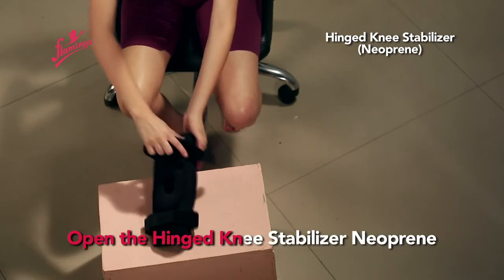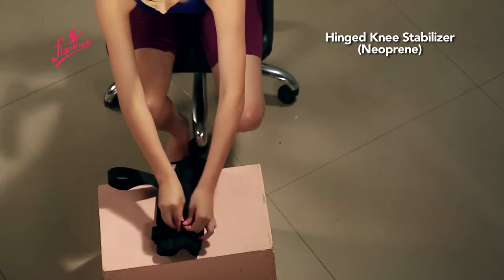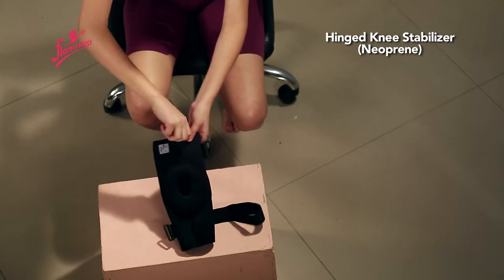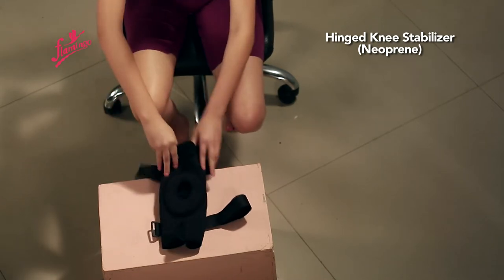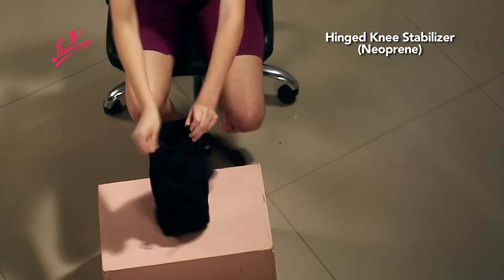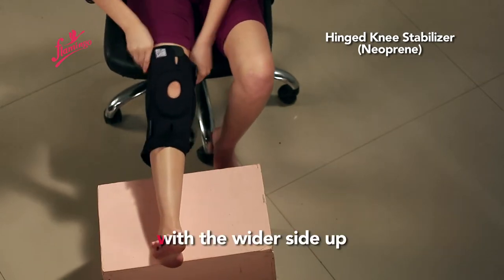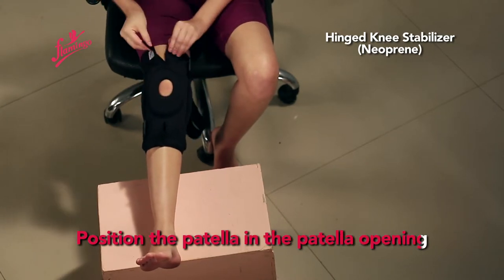Open the Hinged Knee Stabilizer Neoprin. Slide it on with the wider side up, and position the patella in the patella opening.